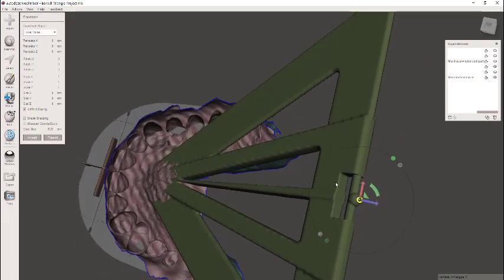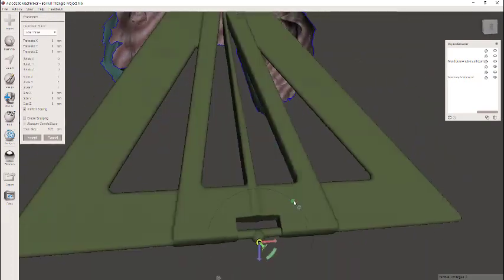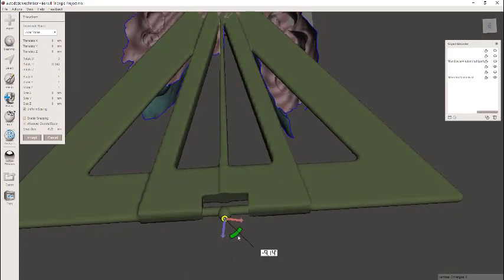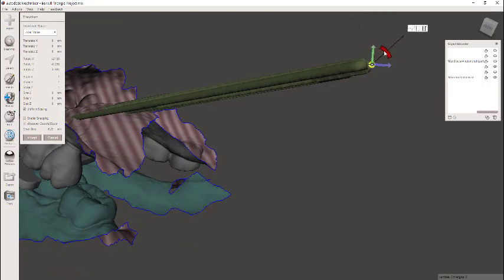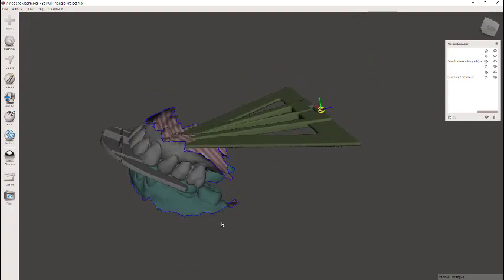You could transform this. Mine did it automatically, but if your pivot was something like that, we don't want to pivot in that direction. We want to actually come in where the red arrow here is going horizontal and parallel to the back of the triangle, and where this blue line is essentially going right through the midline. That's the direction that we want to be able to pivot from. This direction doesn't matter so much. You could make it coincide with this, but that won't really affect things because it's still just going to be pivoting off of that. All right, so our pivot is in place now.